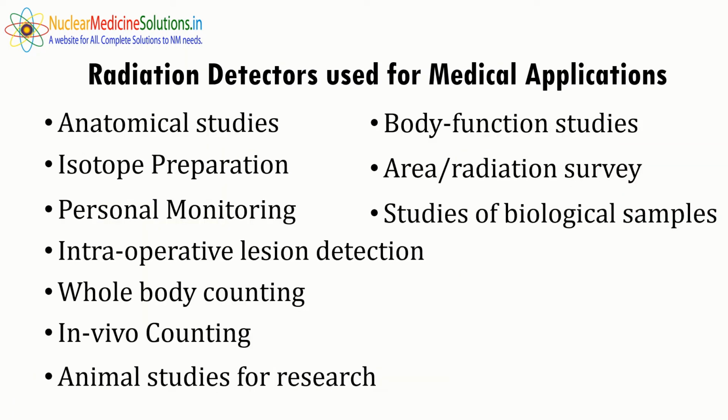So on various occasions for medical purposes, radiation detectors are used, like anatomical studies, body function studies, isotope preparations, area or radiation survey, personal monitoring studies, studies on biological samples, intraoperative lesion detections, whole body counting, in vivo counting, and animal studies for research.